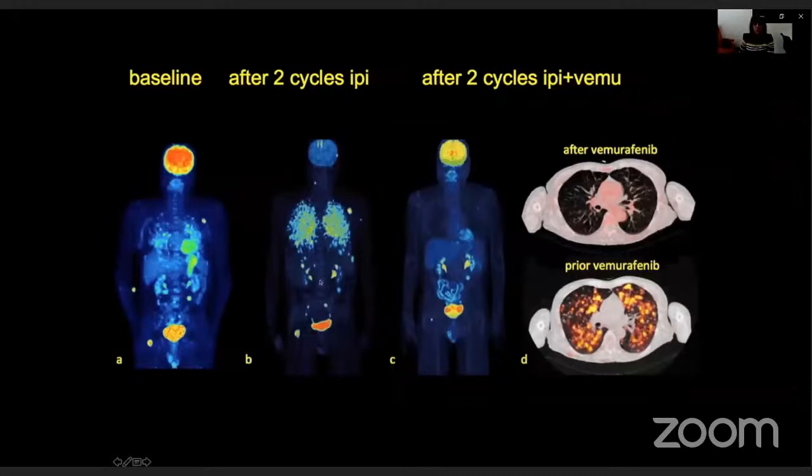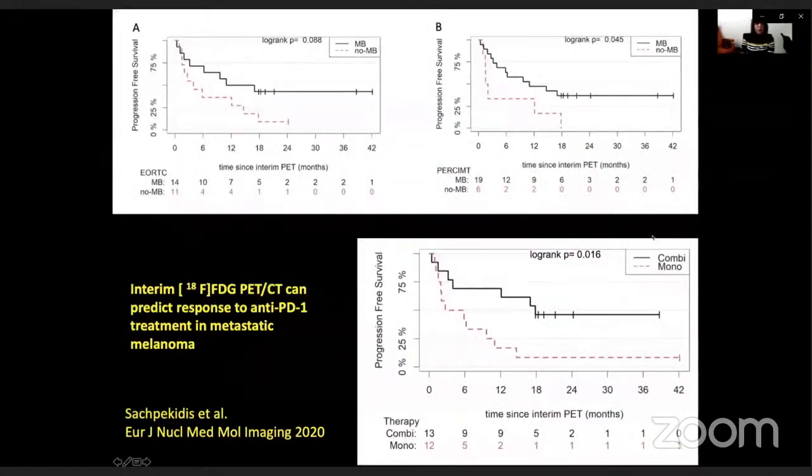Therefore, oncologists stopped therapy and changed therapy to a combination of ipilimumab and vemurafenib. The reason was that this patient has a BRAF mutation, so vemurafenib works in this case. And as you can see here, all lung metastases disappeared after this combined immunotherapy.